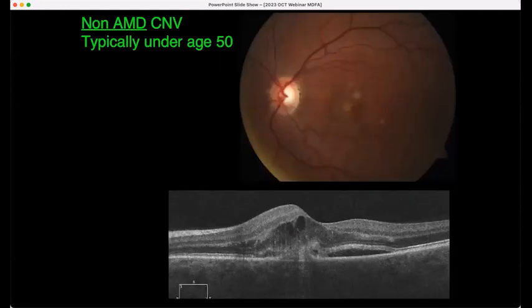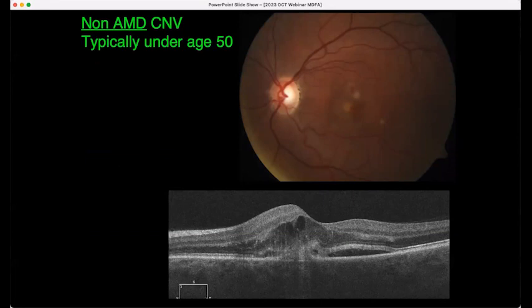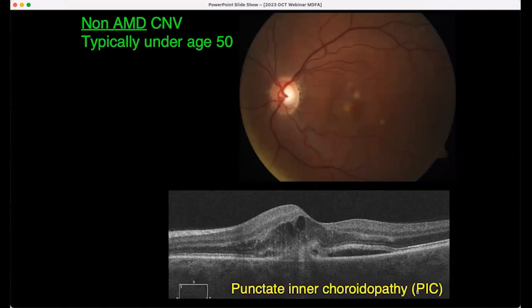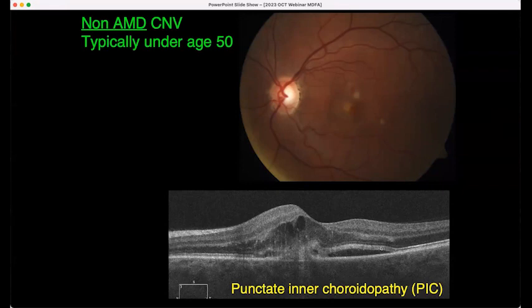You do see other causes for non-AMD choroidal neovascularization — typically patients under 50 without signs of AMD. Myopia is the obvious one, but if they don't have a myopic fundus there are other things to consider. In this case it's PIC — punctate inner choroidopathy — an inflammatory choroidopathy. There are a number of PIC lesions with two hemorrhages, so CNV has actually grown from two spots. That's the CNV, subsensory fluid between the RPE and sensory retina, cystic intraretinal edema, and some non-cystic swelling.